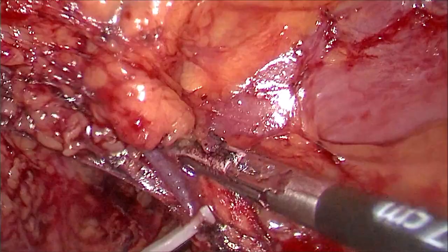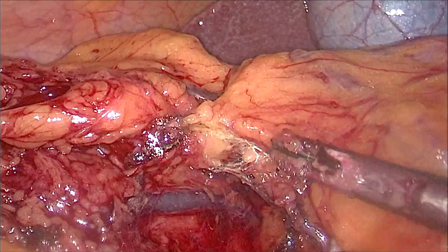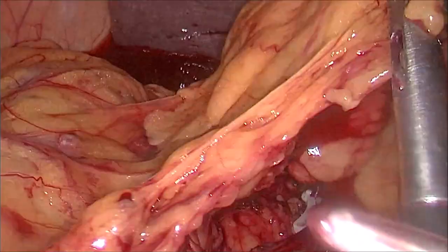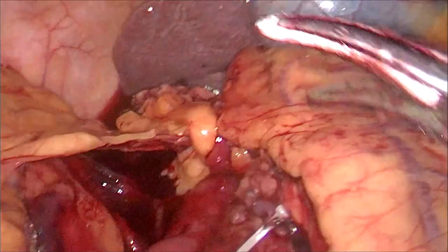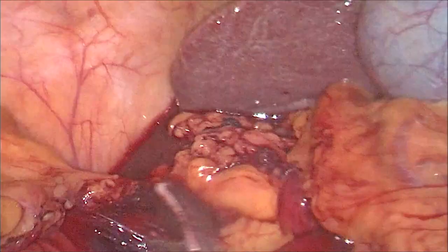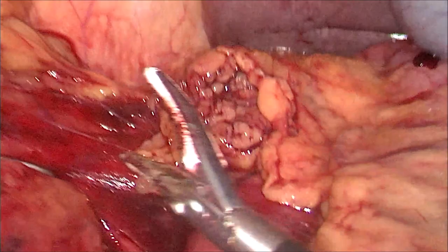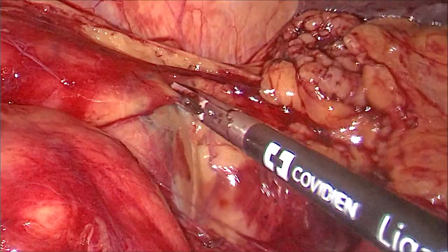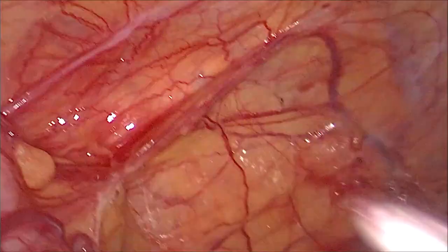Lymphadenectomy is also performed here. As discussed earlier, having completed most of the dissection from below, there will be no more major vessels to be ligated. Small gastrocolic vessels are taken down with the vessel sealer. The lateral attachments of the right colon are taken down as the final part of the procedure, using a combination of sharp and blunt dissection to free the last few attachments of the right colon from the lateral abdominal wall.